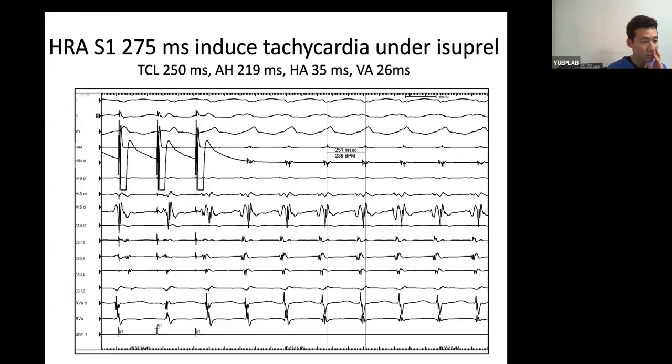9-10, you don't have a signal, so I can't tell. But I want you to also look carefully. 7-8, 5-6 has what? Proper polarity reversal. Okay? And then 5-6 has a very sharp fragmented signal, which is early too. It doesn't belong to the local A. You can see also in 3-4 that sharp potential, almost like a pathway potential. Do you see that? Yeah. Okay. That's a suspicious area. Okay. Let's go next. Keep going.